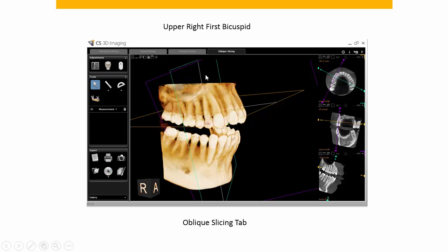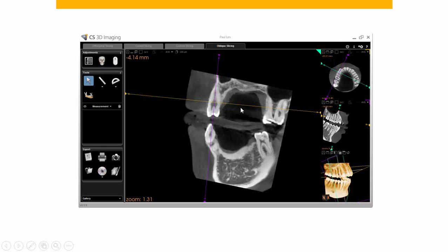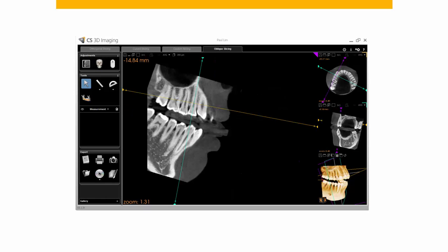I'm going to show you how it's done using the Carestream software. We use the oblique slicing tab because it's very simple to get all the measurements either perpendicular or parallel to the long axis of the tooth. We're looking at the upper right first bicuspid. From the axial view you can see we're looking straight down the long axis of the tooth. From the coronal view these lines are exactly parallel or perpendicular — this represents the halfway point of the partial bone zone, perpendicular to the long axis of the tooth.